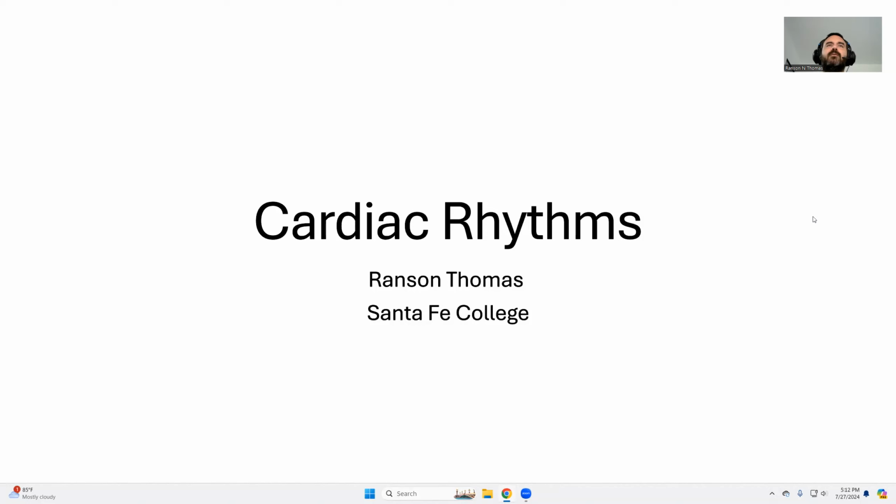We're going to be going over cardiac rhythms today. I'm going to do something a little different with this course. I'm going to break it up into a few different videos. So please leave feedback if you appreciate that, or if you prefer it all in one big long video.